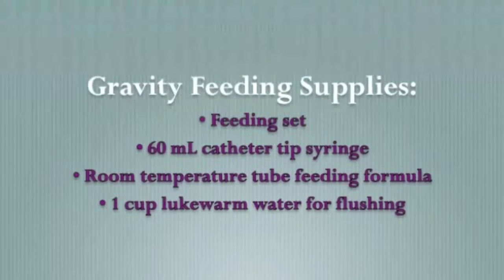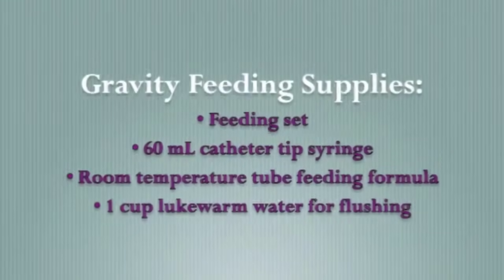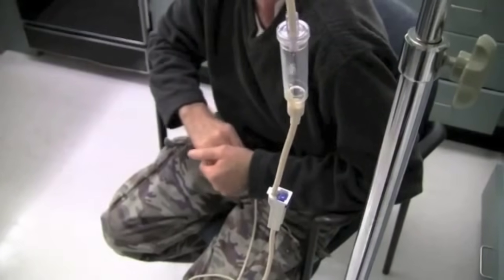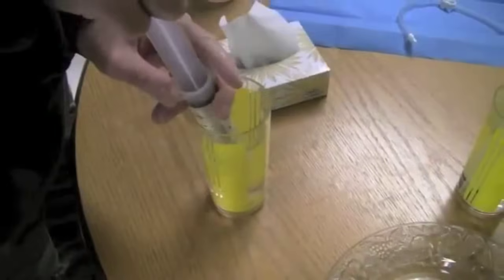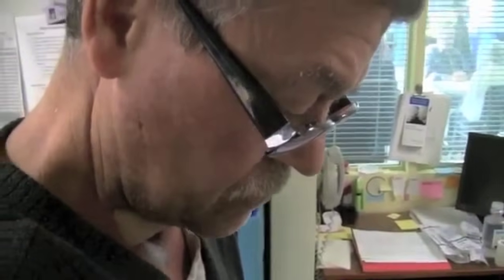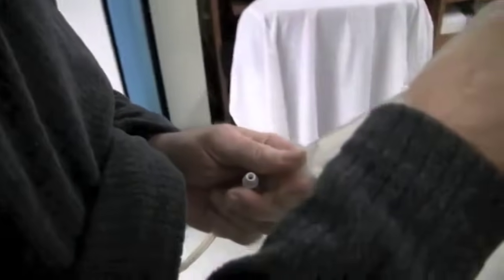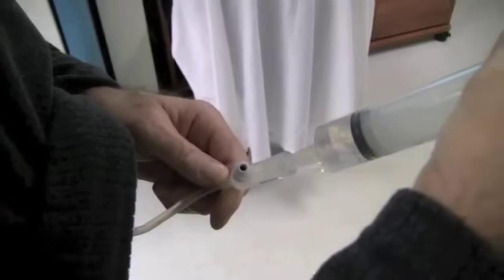There are two methods that can be utilized when feeding through the G-tube: syringe feeding and feeding by gravity. Remember to sit in an upright position during feeding and for 30 to 45 minutes after feeding to prevent regurgitation. First, wash your hands thoroughly. Next, fill the syringe with 60 milliliters of lukewarm water. Straighten out the feeding tube and check tube placement — the mark on the tube should be in the same place as when it was initially placed. Hold the tube above stomach height or pinch the tube and open the stopper or tube tip. Place the tip of the syringe into the end of your feeding tube and plunge the water through the tube. Cap the tube tip.